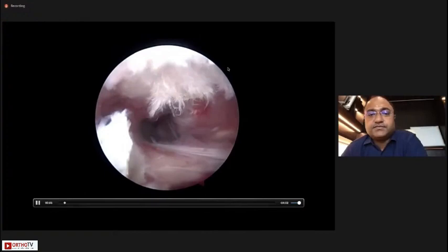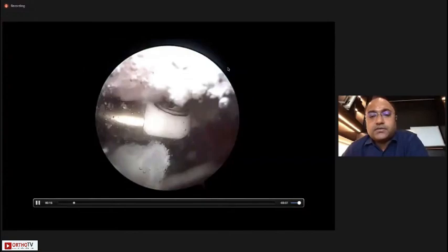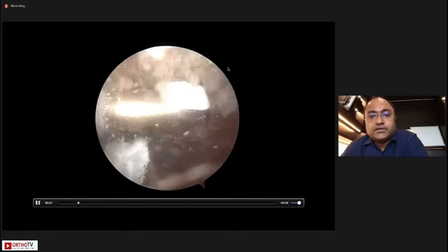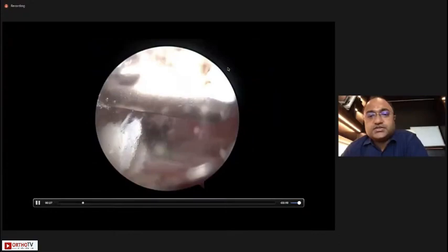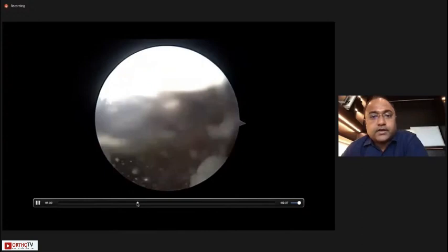We never cut the coracoacromial ligament — we just recess it with the radiofrequency device. We need to expose the anterolateral corner of the acromion, which is where impingement has been documented to be primarily responsible. The goal of the CA recession is to create space between the repair and the acromion so there is no impingement after the repair.